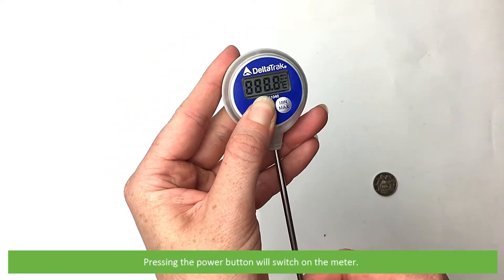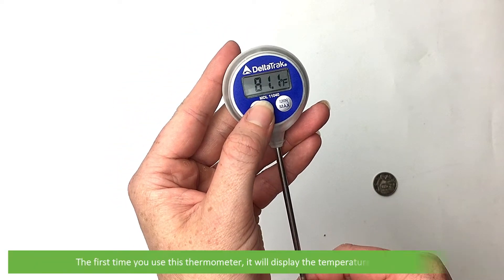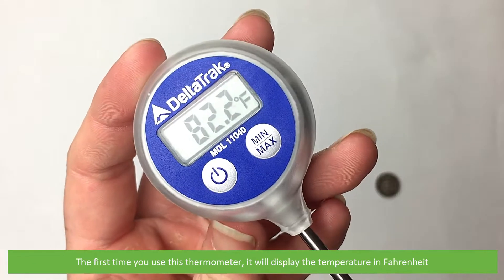Pressing the power button will switch on the meter. The first time you use this thermometer it will display the temperature in Fahrenheit.